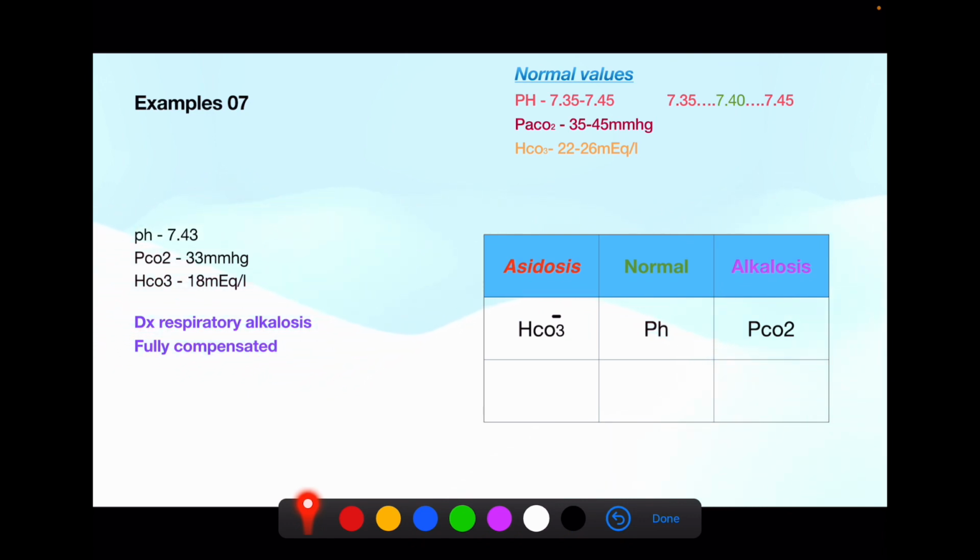From today onward, when you get a critically ill patient and do your ABG, don't just go and give the interpretation. Take a little time, a piece of paper and a pen. Put the charts according to what I have shown you, three separate columns, and put these parameters into the columns. Then you will automatically be driven to your diagnosis. If you work it out in your mind, you might miss some important facts. But if you stick with this system, you won't make any mistake.